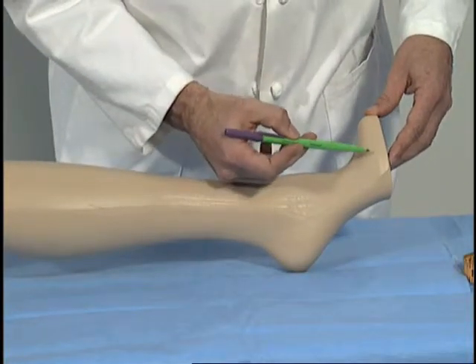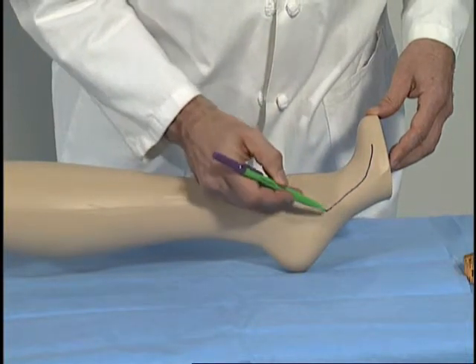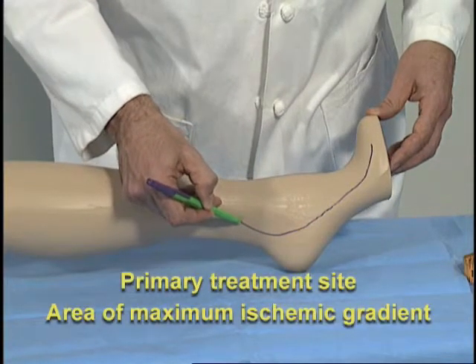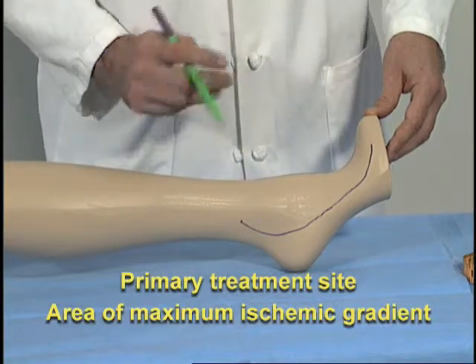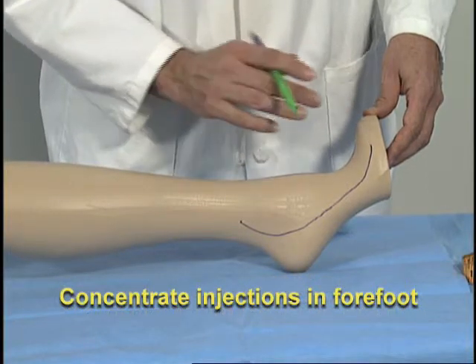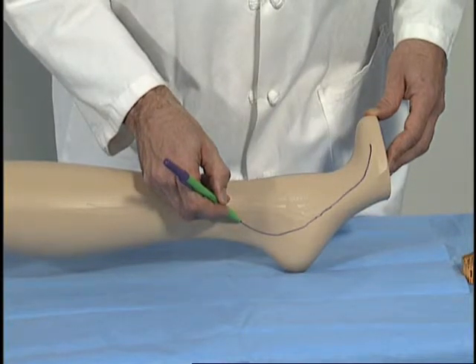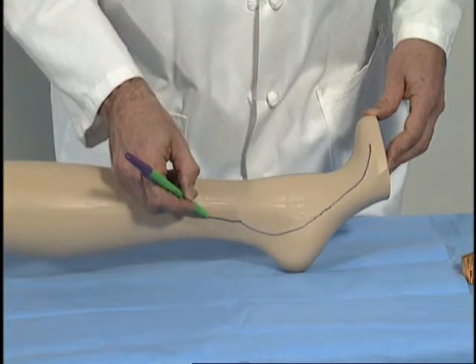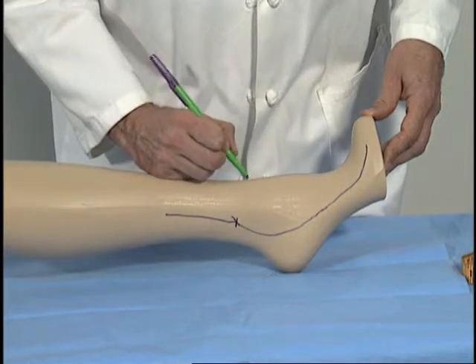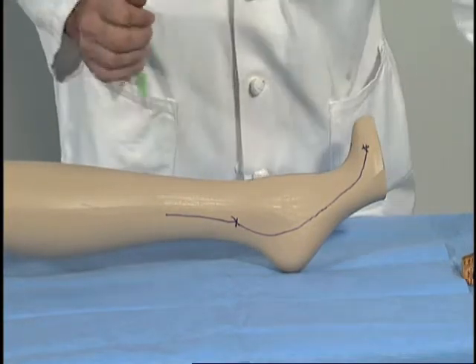Then we will also trace the posterior tibial distribution across the plantar aspect, trying to work on the tarsal branches and around the ankle as our primary site of treatment. This is forefoot ischemia, and we want to concentrate our injections in the forefoot. If we find that we have additional capacity to use our 40 injections, we can continue up along the posterior tibial, but remembering that the forefoot is the primary target. So we'll mark out our primary targets.